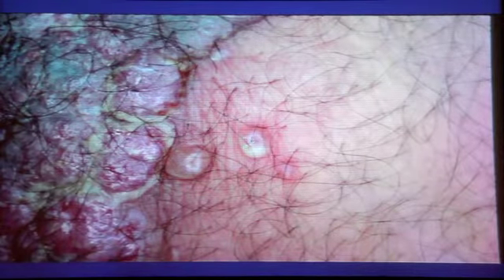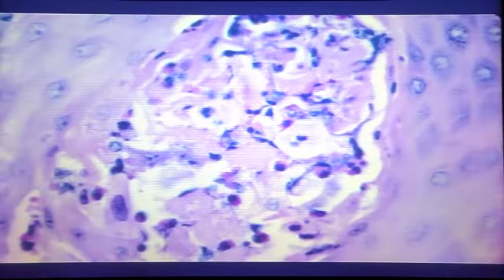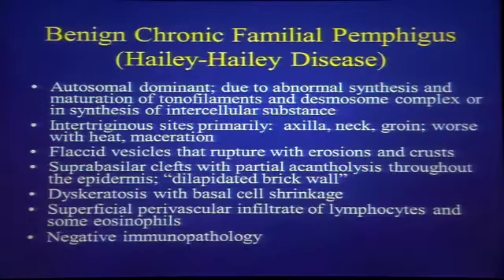And you get these little intact blisters here with some neutrophils. And then you see these nice clefts here and the overlying epidermal hyperplasia, which correlates with that verrucous epithelial hyperplasia. This condition will often be associated with eosinophils in the infiltrate too, interestingly enough. And you may get these little clusters of eosinophils within those blister spaces in the epidermis.